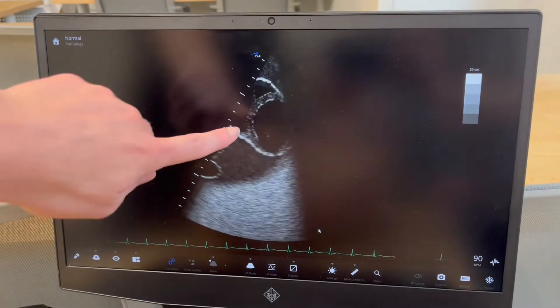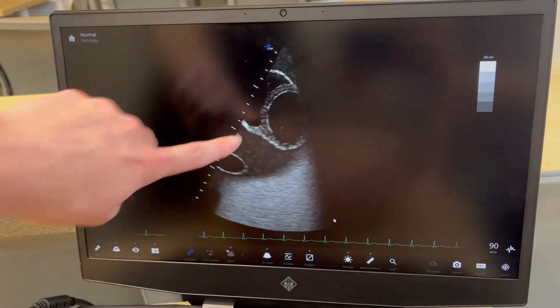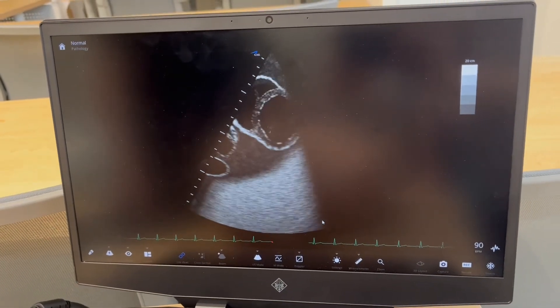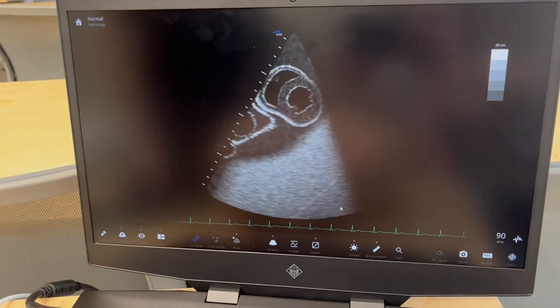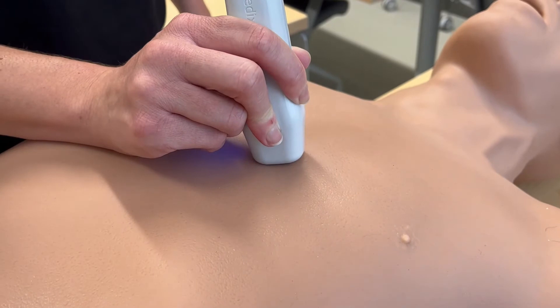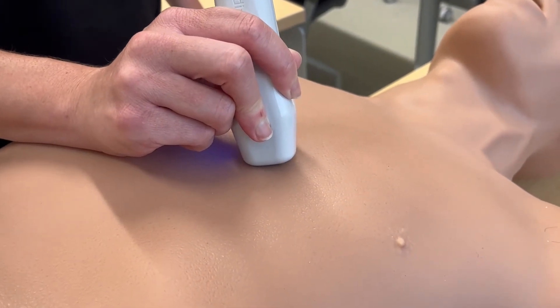What you see on the screen here is the valves flickering in and out. For the parasternal short axis view, we want to be just below the level of the valves at the level of the papillary muscles, which you can now see here on the screen. To achieve that, I angled my hand to point more towards the apex of the heart to see farther down into the ventricle.